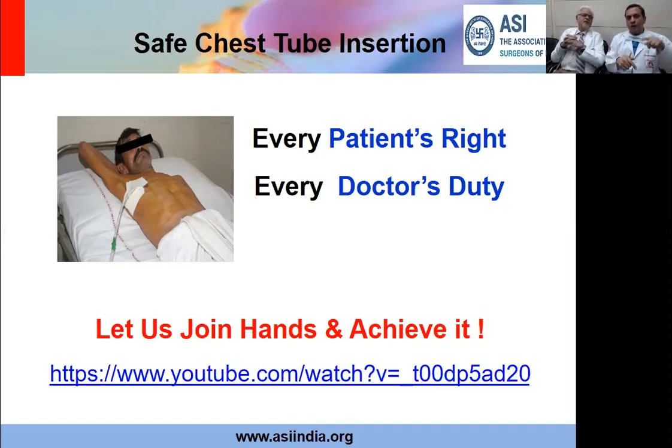So what happens is that the column swing, as we call it, depends on how much difference in pressure is occurring inside the chest with inspiration and expiration. Whenever you have the lung fully expanded, there will be very little change in pressure during inspiration and expiration, and your column swing will be minimum. Whenever after lobectomy the remaining lobe does not expand and you still have a lot of space there, that space leads to wide changes in pressure between inspiration and expiration, and that leads to a wide swing. So if you are seeing a wide swing in the column, it means that there is some space still present inside. But as I said, complete lung expansion clinically and radiologically, no air leak for more than 24 hours, no blood, no fresh blood, no altered blood, no pus, and drainage between 100 to 200 cc. That is the time we will remove the chest tube.